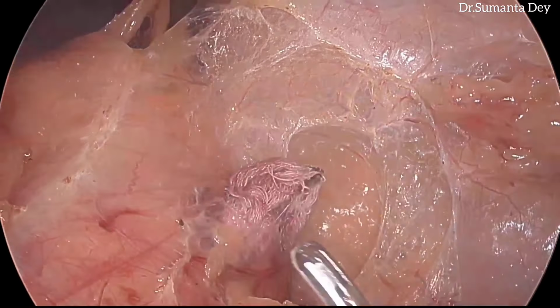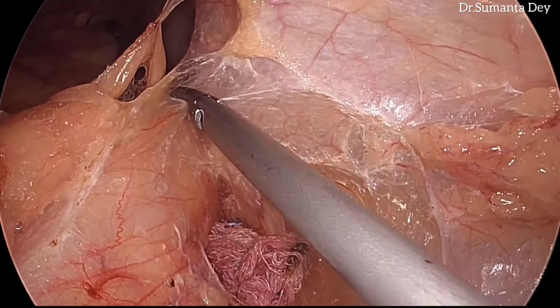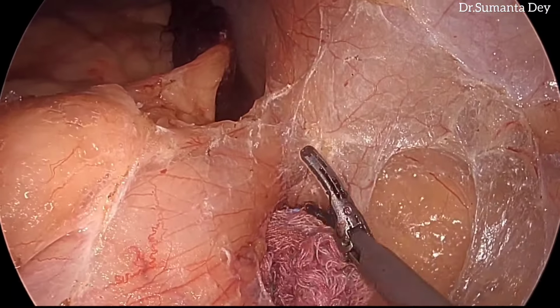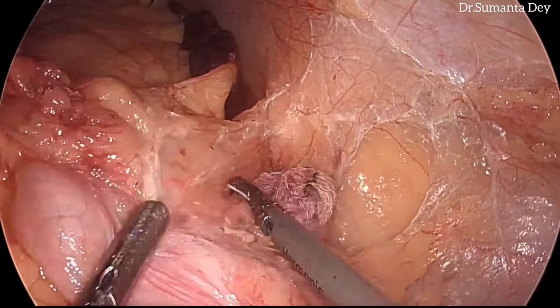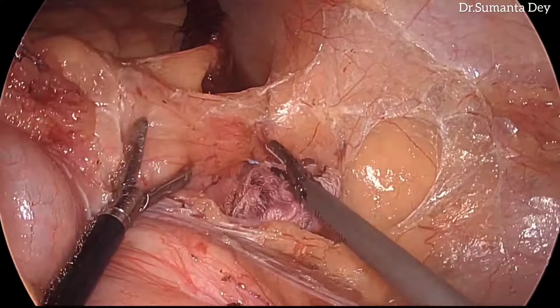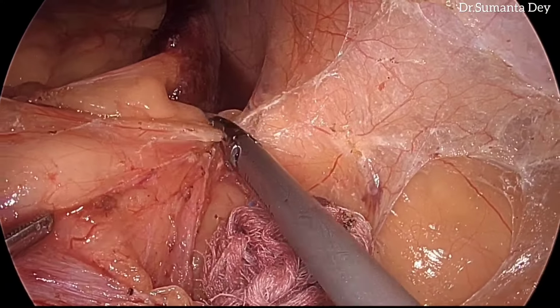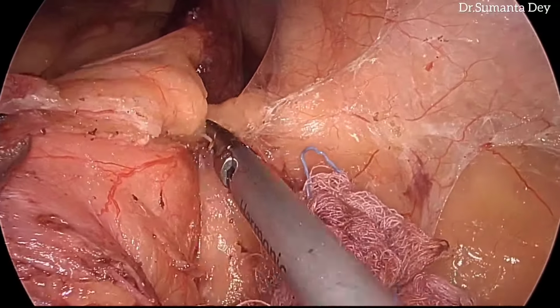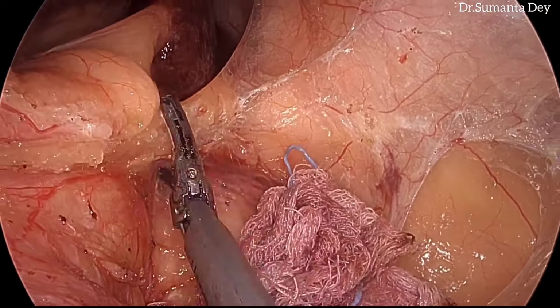So you can see that is the lateral to medial mobilization of the colon now, and the gauze piece that I have kept below the left mesocolon can be seen. The two planes are being connected gradually now, so that I can completely reflect the left colon from the medial aspect to the lateral aspect, and from the lateral aspect to the medial aspect.